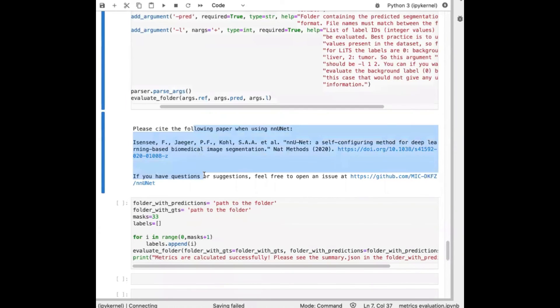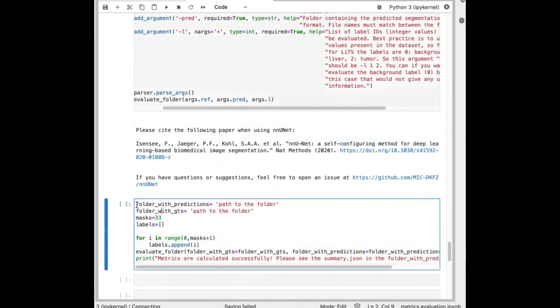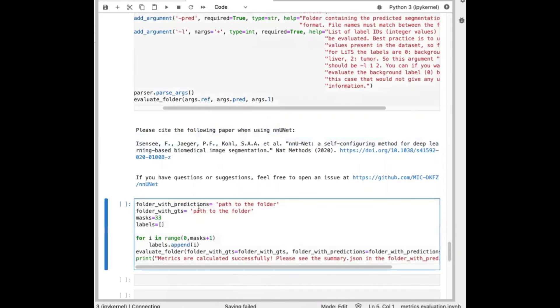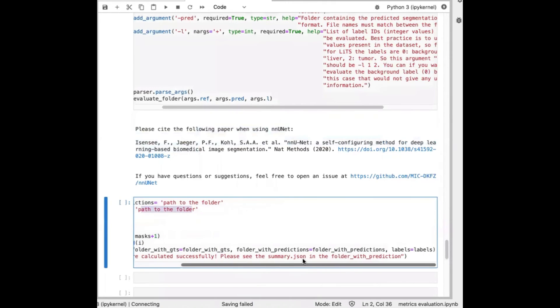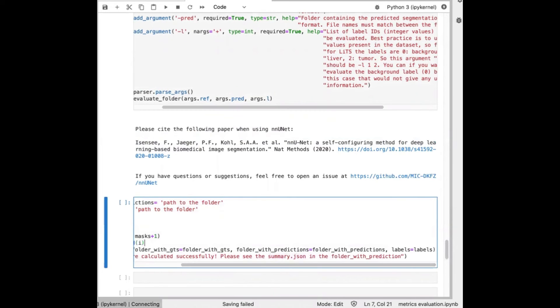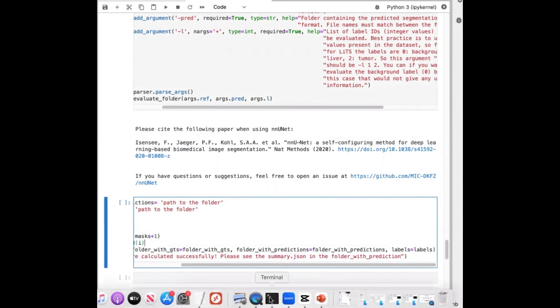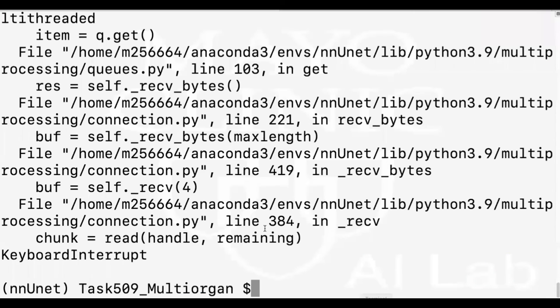And then you just need to add these few lines of code where you have to define the folder for predictions and ground truths. And then we run the command and you'll see a summary.json that has the results in it.